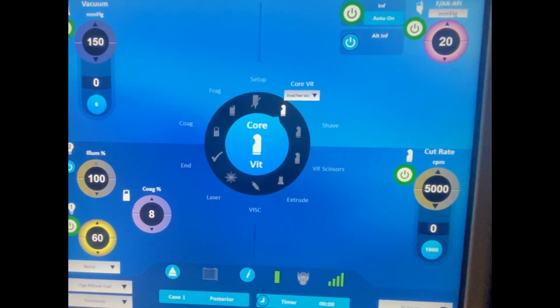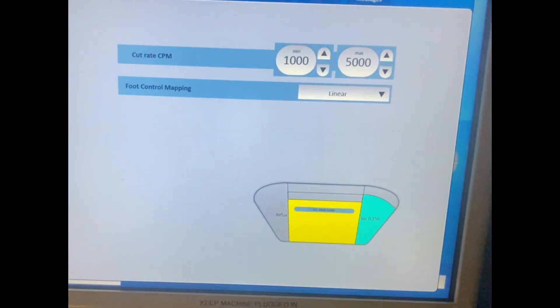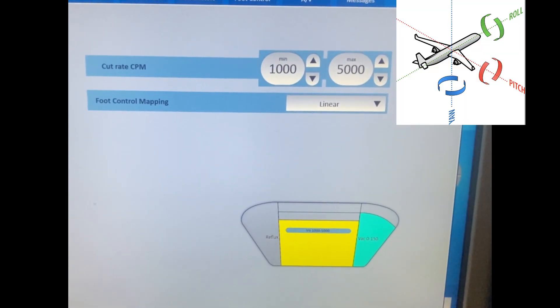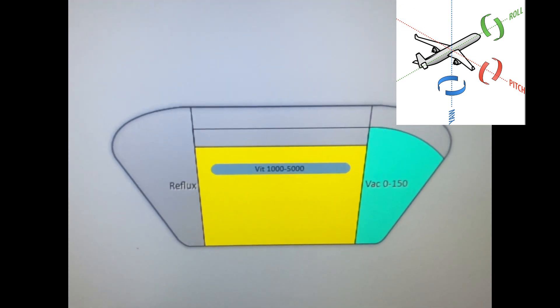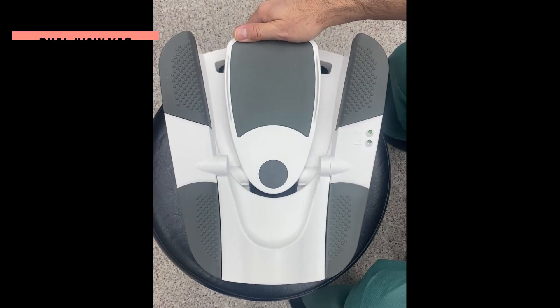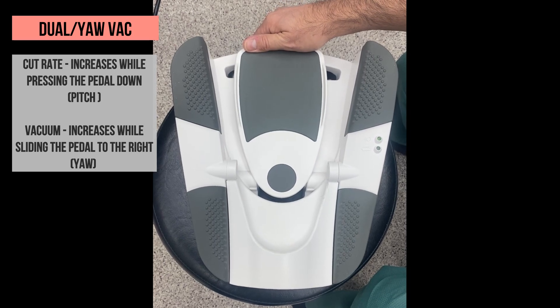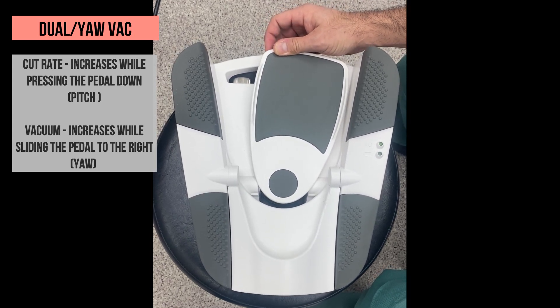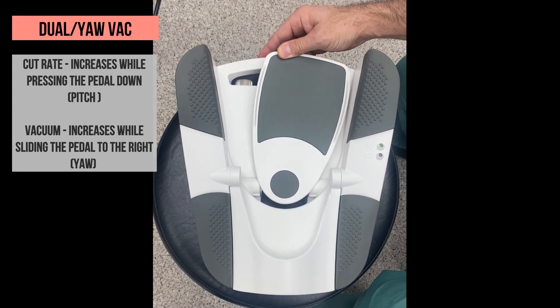The next sub-mode is Dual Yaw Vacuum. Here, both the cut rate and vacuum are not permanent. Unlike in linear vitrectomy, this change occurs independently from each other. In this sub-mode, in pitch — which means pressing straight down on the pedal — the cutting rate will increase, and in Yaw — which means sliding the pedal to the side, in our case to the right — the vacuum will gradually increase. Now the pedal is in pitch and you can hear how cutting increases while pressing the pedal down. Sliding the pedal to the right turns on the vacuum and gradually increases it while sliding more to the side. Standing with the pedal to the side and down position allows to use both cutting and vacuum.